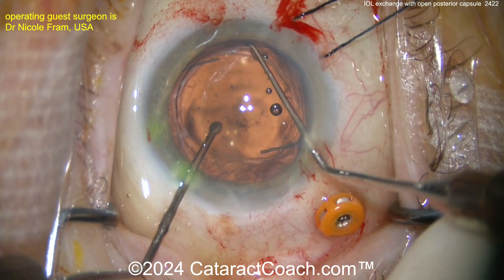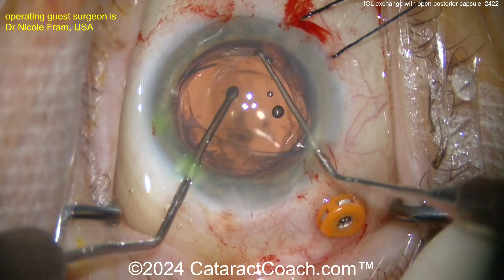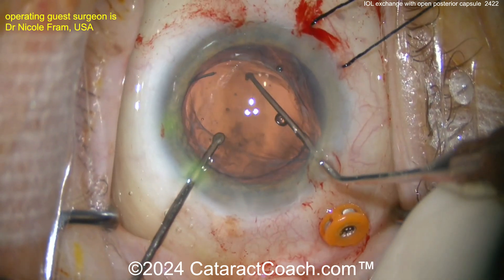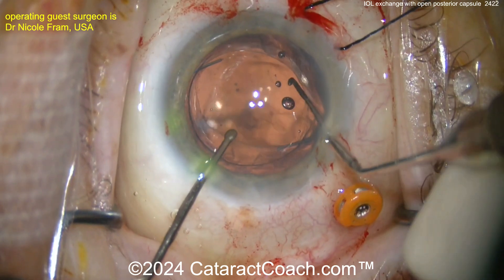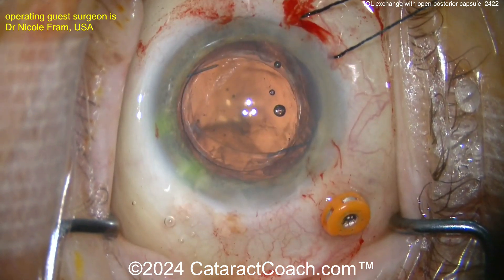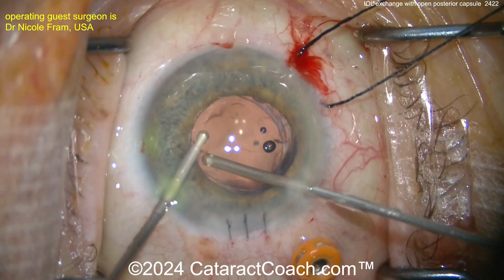The biggest challenge of this case is what the post-op patient is going to say: 'I can't read.' Yes, distance vision is better, it's really clear, there's no glare, there's no halos — but I can't read. And as an ophthalmologist you say, well, of course — I told you that. You're taking out a trifocal lens which gave you a wide range, and we're putting in a monofocal lens.